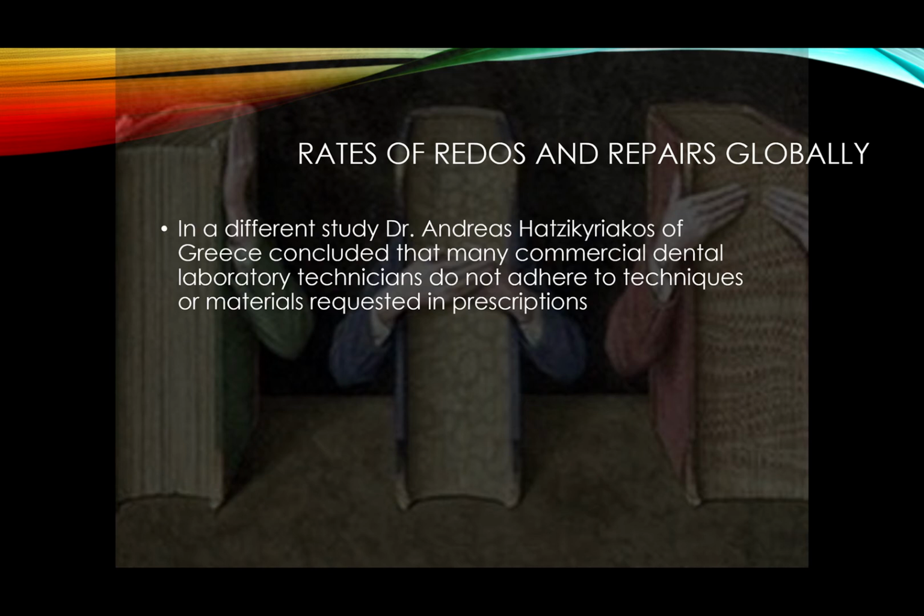What if the tooth is just strictly A2, without much translucency and without cervical staining? You have to have information to proceed to level up, or to move from whatever is prescribed in the prescription to an extra step. Like, for example, a photo. You get a photo and you see, oh, there's yellow staining.